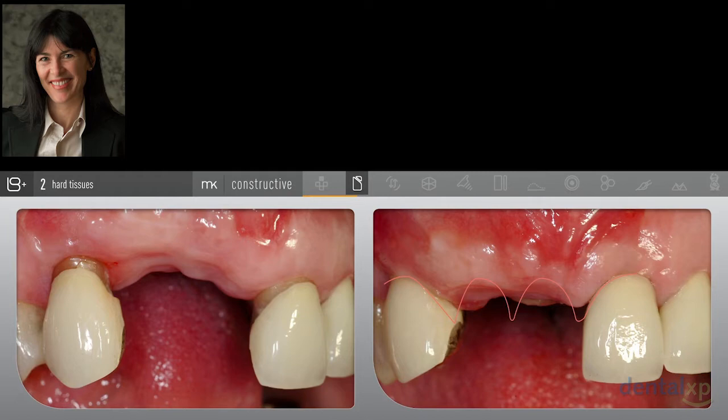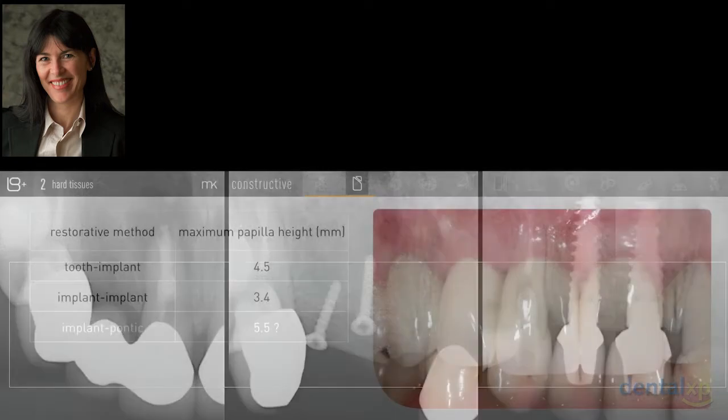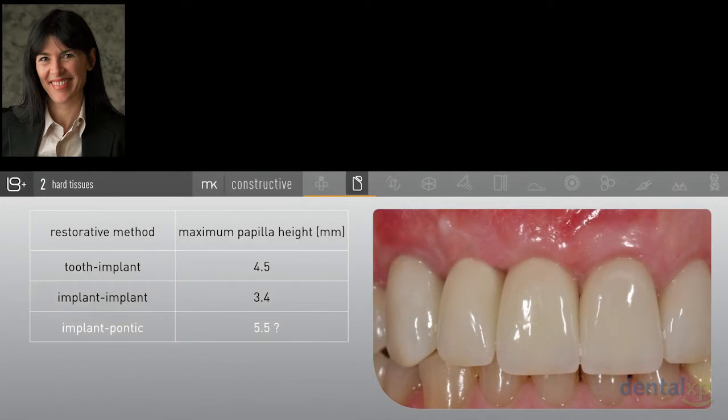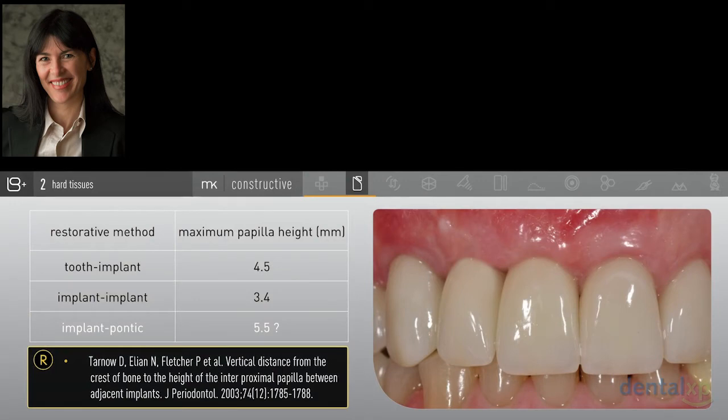And historically, a lot of us would have always done 1 implant and a cantilever to avoid the side-by-side implant situation. Because even though I thought I did things right, I augmented it effectively to the level of the adjacent bone. I've used an implant which gave me good primary stability. I have excellent crestal bone stability. And yet, despite that, we see the aesthetic outcome is compromised. Really, the architecture is not perfect. In this patient's lip line, which is forgiving, it's fine, it's acceptable, but it's not really where I aimed for.